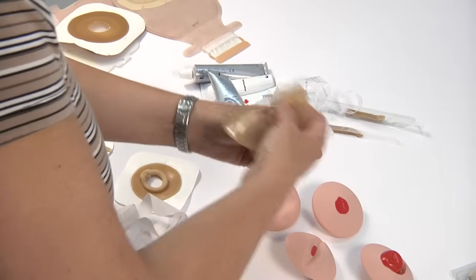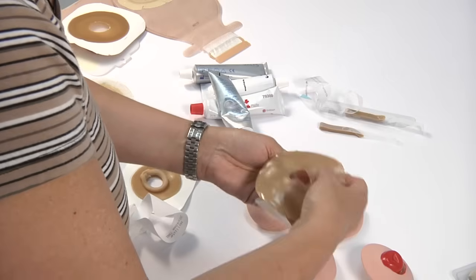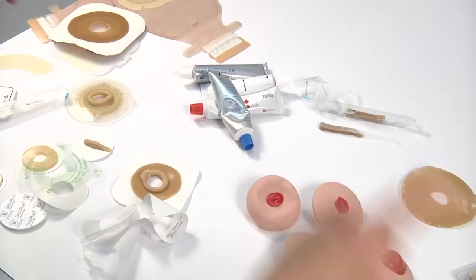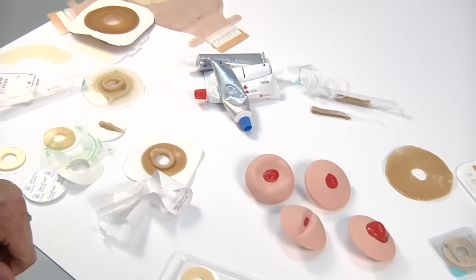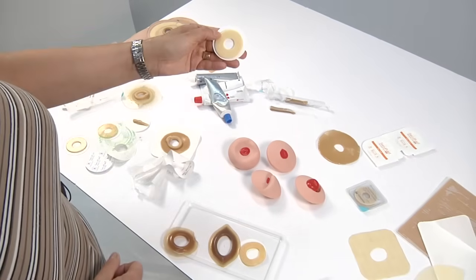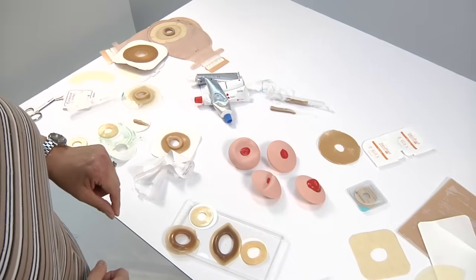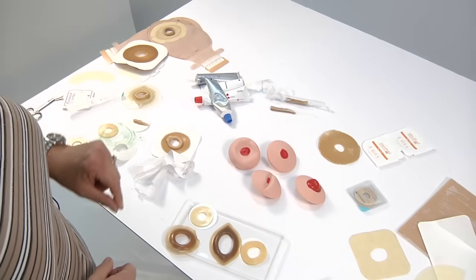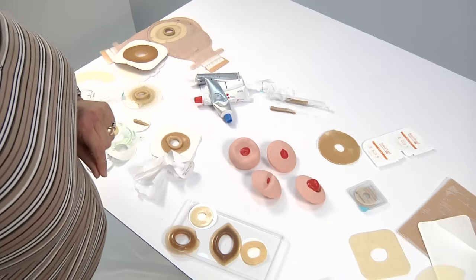All of the barrier rings are relatively, or comparatively, expensive when you think about the range of prices that you see here, and the rings will start anywhere from about $6 for a smaller ring like this, and when you start getting into the larger rings or the oval rings, you're starting to get closer to $9, $10, $11 for them. Lastly, we have barrier sheets.